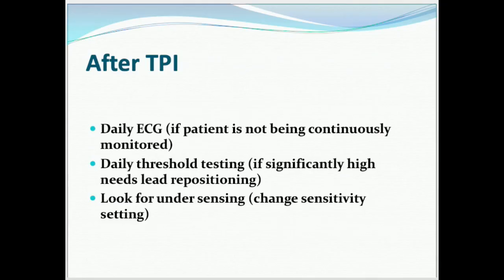After temporary pacemaker implantation, the patient needs to be monitored continuously. Daily ECG must be taken if the patient is not being continuously monitored. Daily threshold checking should be done. If significantly higher, lead repositioning must be considered. And if there is undersensing, the sensitivity must be reset or changed.